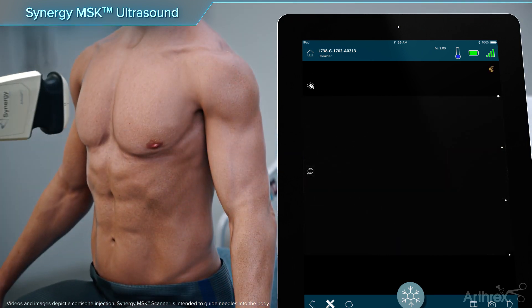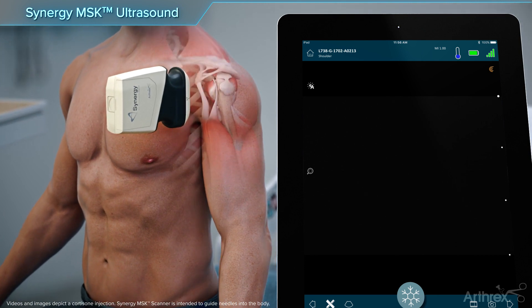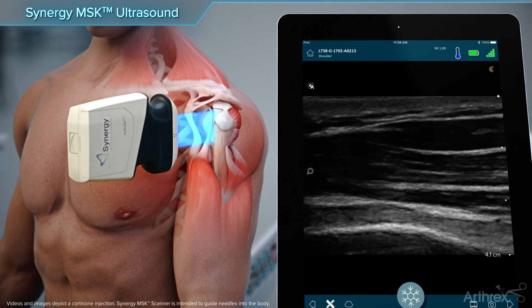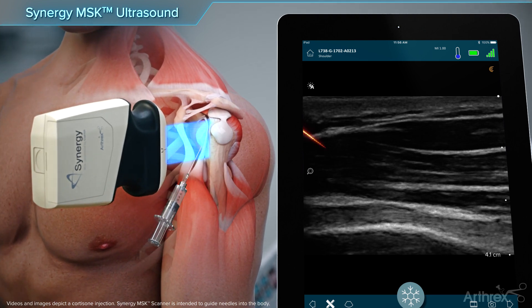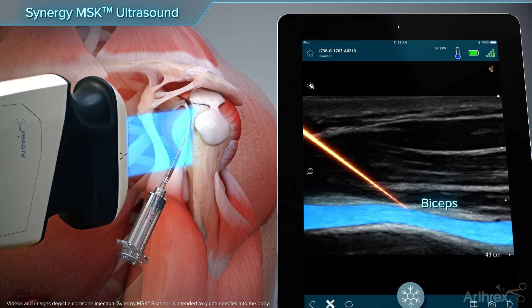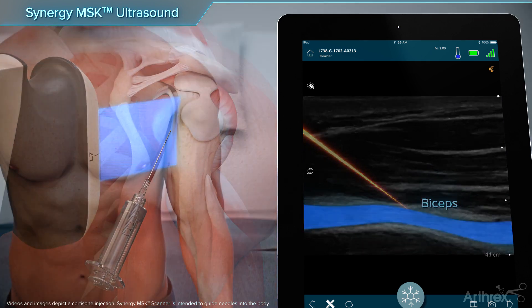To visualize the long head of the biceps in long axis, the arm is relaxed in a neutral position with the hand supinated. The scanner is placed over the bicipital groove longitudinal to the biceps tendon. The needle is directed to the synovial sheath in plane with the scanner from an inferior direction.